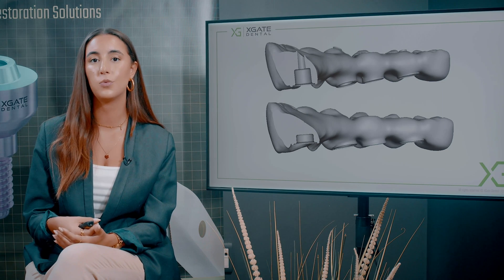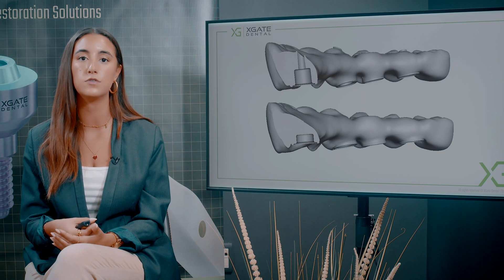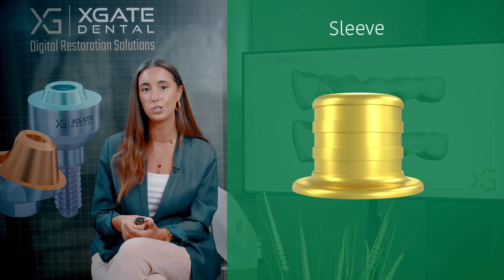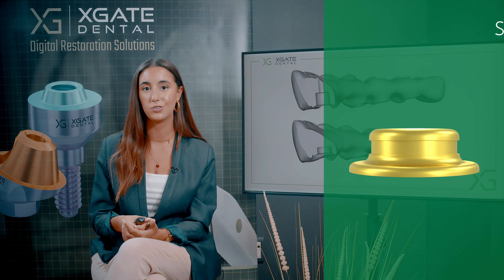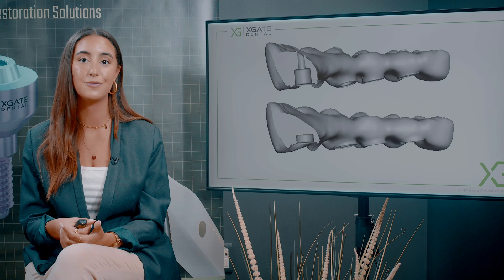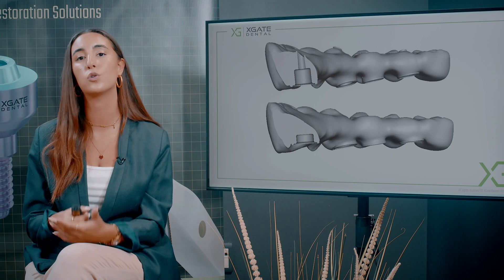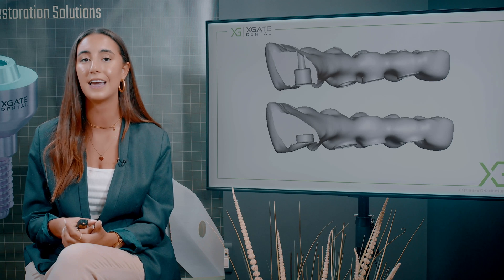We eventually saw in this case that when we switched from a three millimeter sleeve to a one and a half millimeter without the screw, it didn't break with the provisional bridge. We made a zirconia bridge and it didn't break down either. It has held for a year and a half at least in the mouth, withstanding all of the pressure and forces on top of these implants and sleeves.